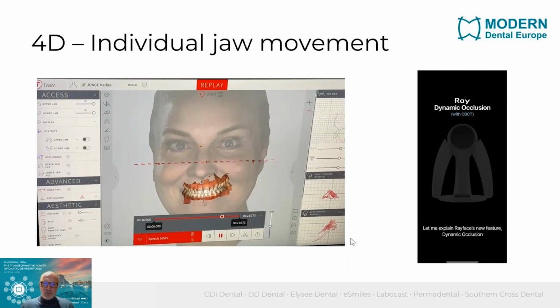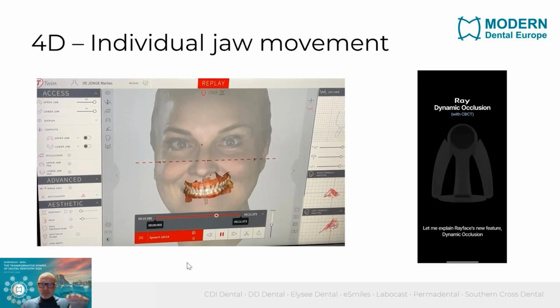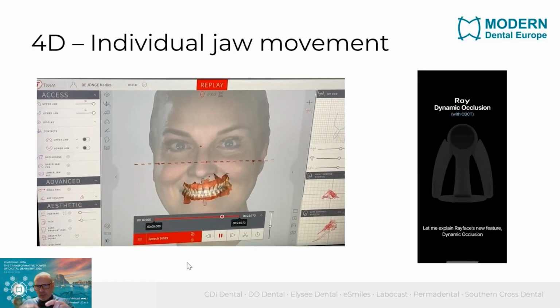So how does it work? It just uses, I will play the video again, optical tracking to really record the dynamic jaw movements. You see also from both condyli the envelope of movement, and there you can also compare left and right condyles to see if you have maybe disorders which should be addressed in the treatment or during the production or fabrication of, for instance, a denture, an All-on-X work, to prevent premature contacts and chipping, etc. So very interesting.